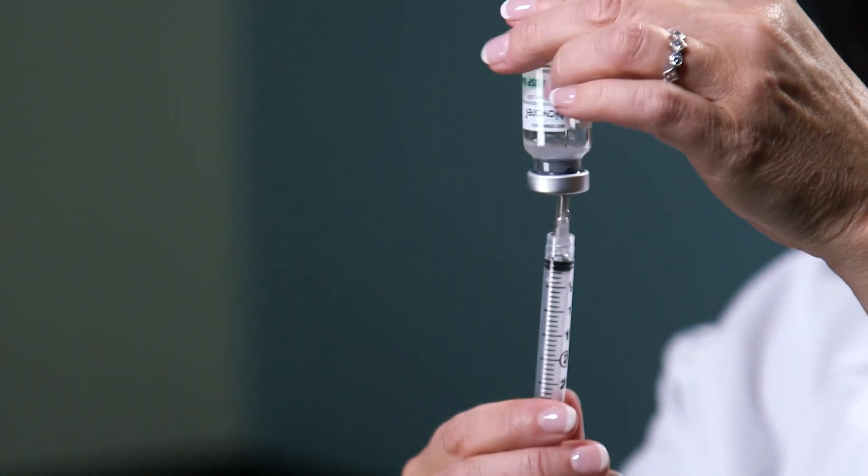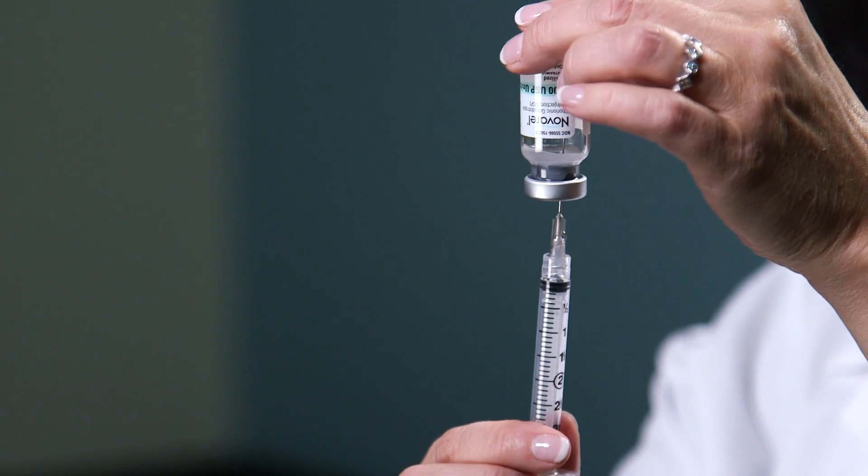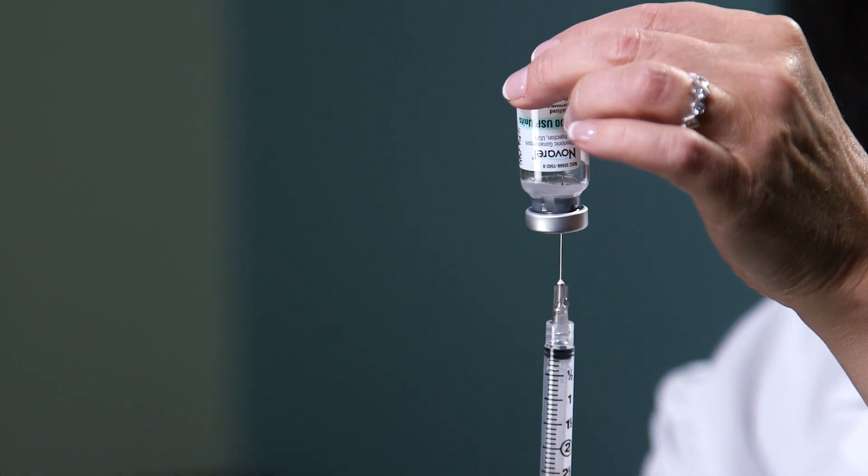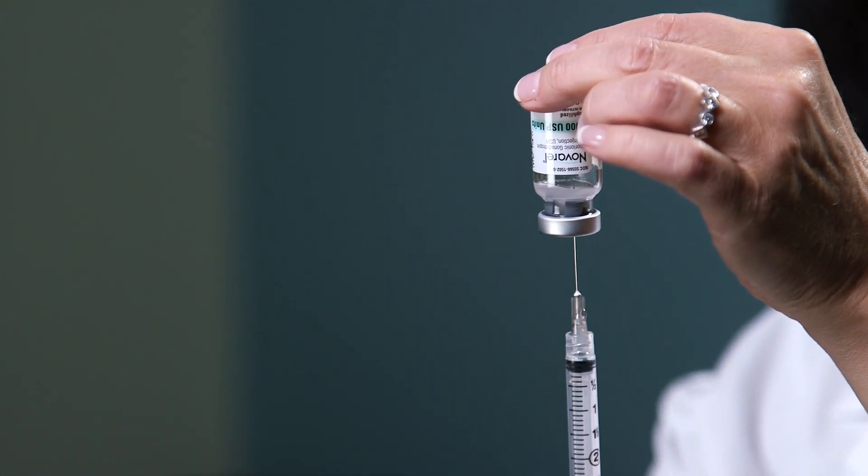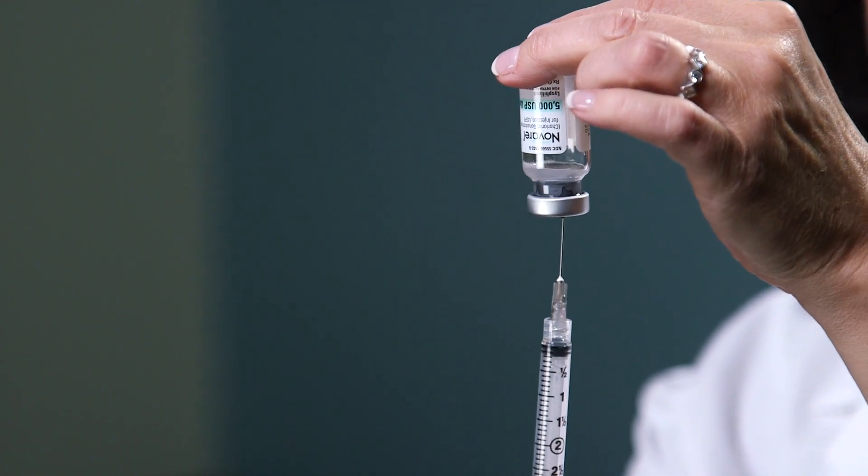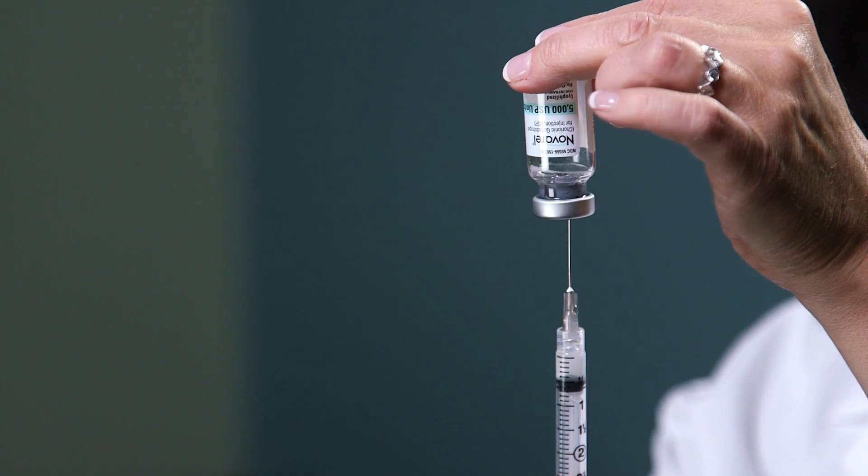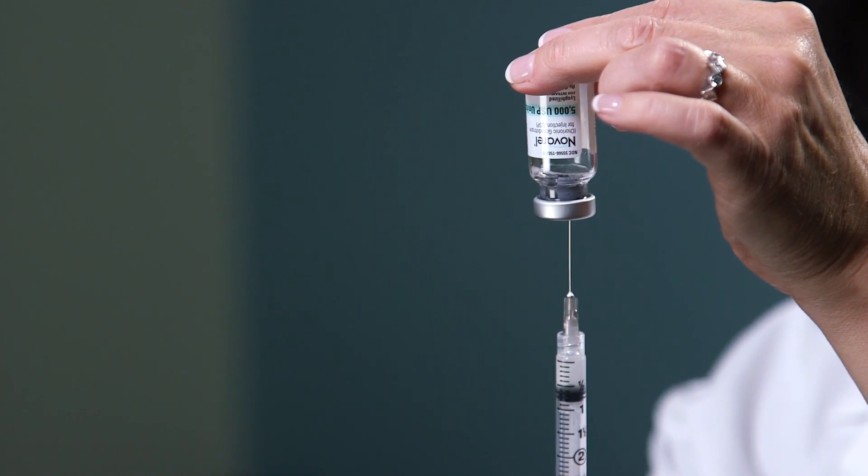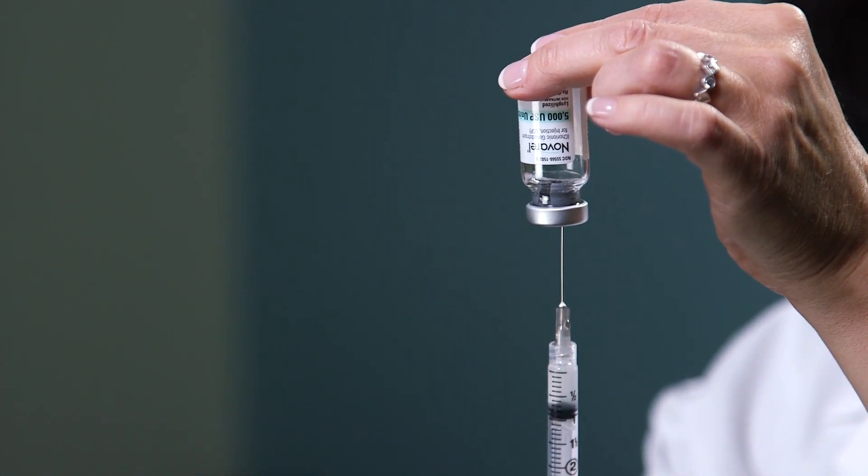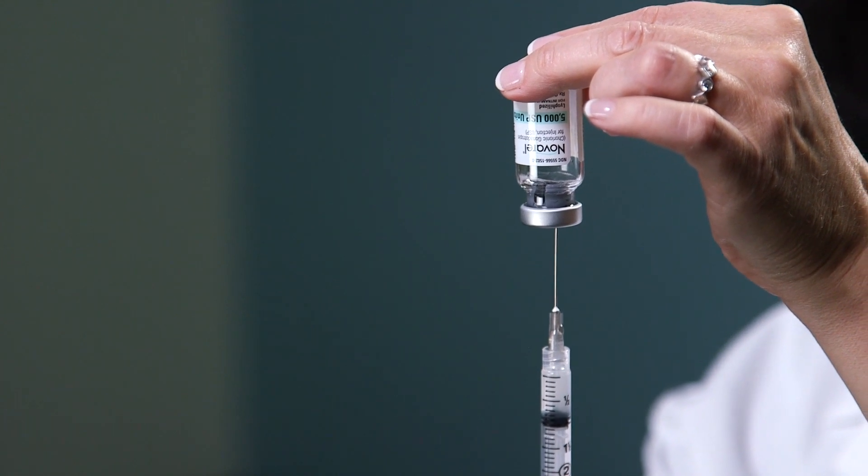Turn the vial upside down. Pull the needle down so the very tip of the needle stays within the liquid. It's a very small amount of liquid. You're going to be gently pulling down on the plunger while at the same time backing the needle out of the vial, so that it stays in the liquid the whole time.